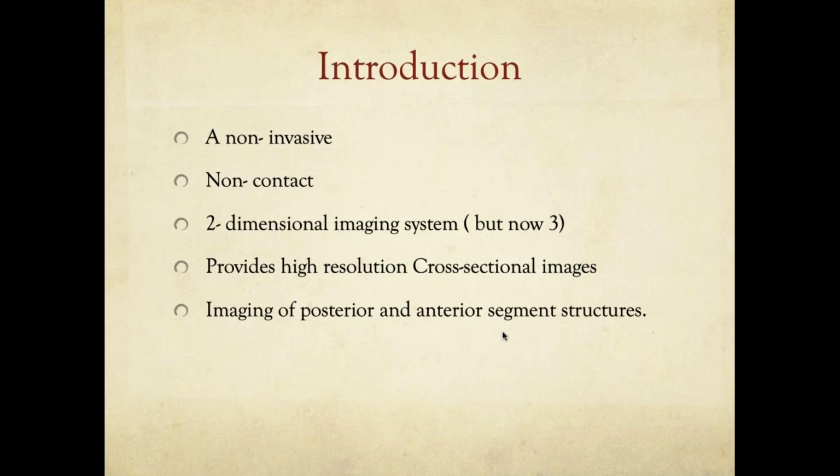So it's a non-invasive, non-contact, two-dimensional imaging system initially, but it's now three-dimensional and provides high-resolution cross-sectional images. So imaging of the posterior and anterior segment structures are also possible.